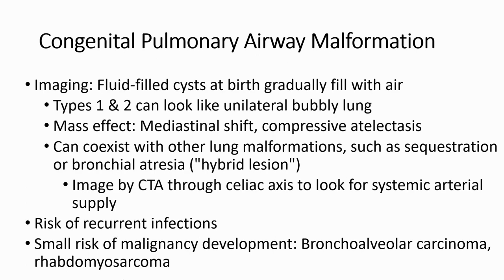So in the imaging, what we have to find is fluid-filled cysts at birth gradually filling with air. Type 1 and type 2 can look like unilateral bubbly lung. It has mass effect, so mediastinal shift and compressive atelectasis. It also can coexist with other lung malformations, such as sequestration or bronchial atresia, so we call it a hybrid lesion.